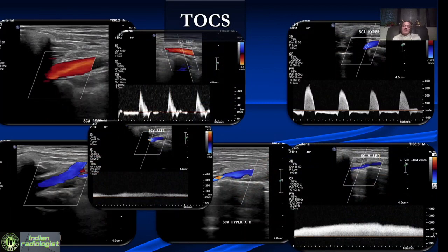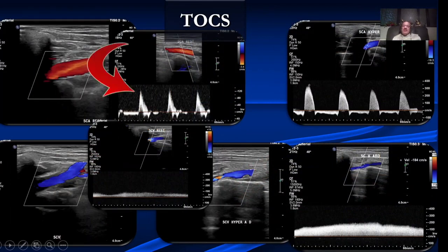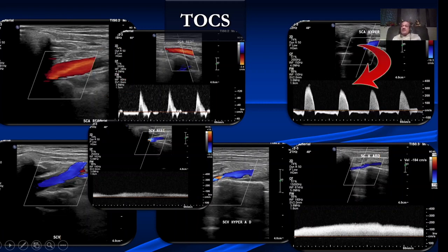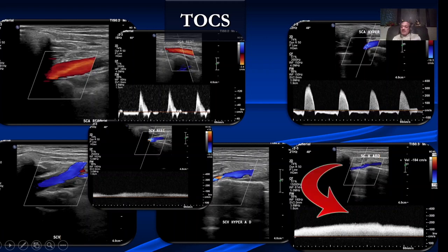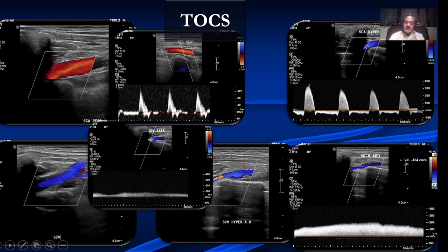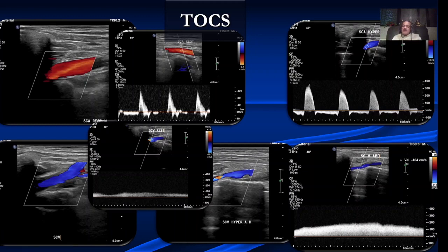That patient had thoracic outlet symptoms. We can see the subclavian artery at rest has a velocity of about 80, but after the Roos test, the velocity increases to about 300 centimeters per second, indicating the artery is narrowed. Looking at the vein — at rest it is normal, but after hyperabduction and hyperextension maneuver, there is narrowing of the subclavian vein with increased velocity, typical of thoracic outlet syndrome. Dr. Raju Wadhwa from Hinduja and I were among the first to describe venous changes in thoracic outlet syndrome.